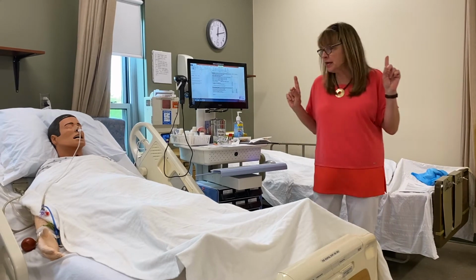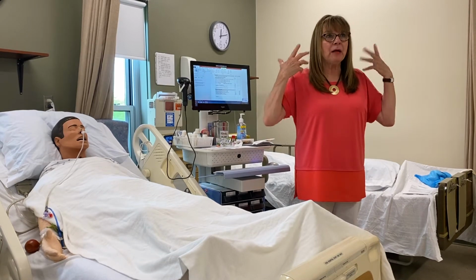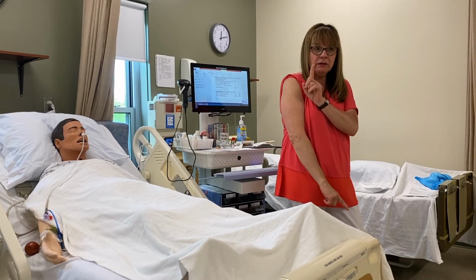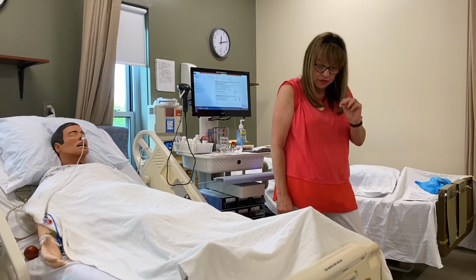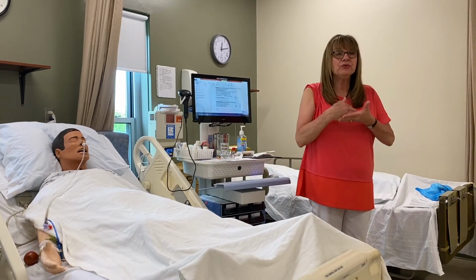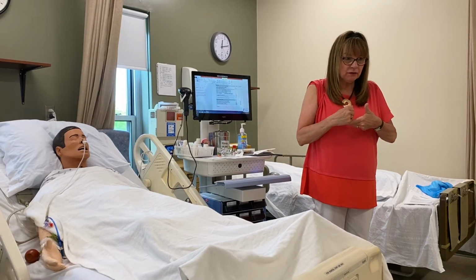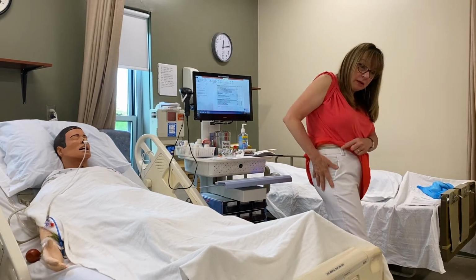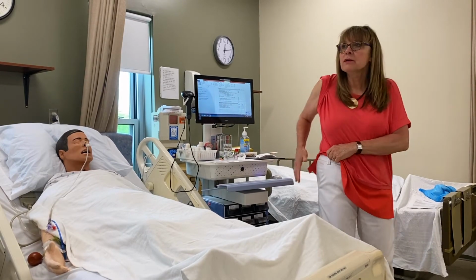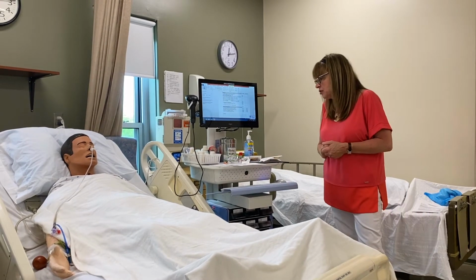So to review one more time before we start dispensing medications, you're always going to palpate your IM sites. When you give a medication in the deltoid, 1 ml, 22 gauge, 1 inch. When you give a medication in the vastus lateralis, up to 2 mLs of injectate can be given, 22 gauge, 1 inch needle. And if you're giving a larger amount, up to 3 mLs, which is the max that you can give, you're going to use it for the ventral gluteal, 22 gauge, 1 1/2 inch needle.